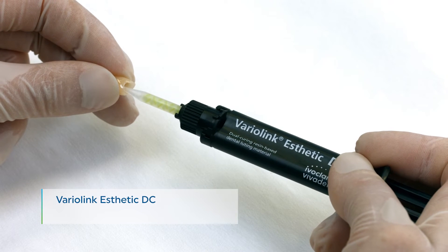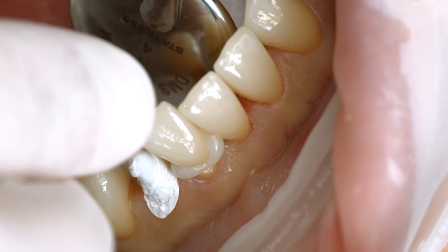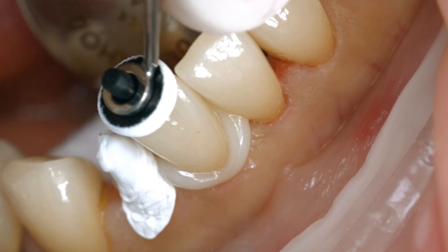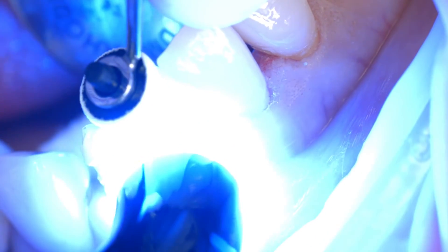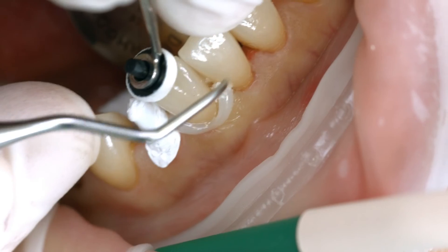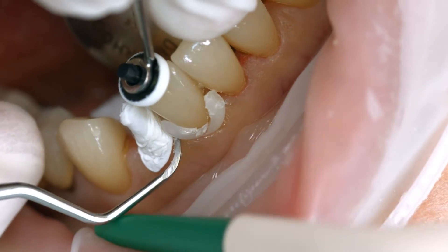Apply the desired amount of Variolink Aesthetic DC directly from the Automix syringe onto the restoration. Seat the restoration and retain it in place exerting uniform pressure. Light cure cement excess for 2 seconds per quarter surface using blue phase style, for example. Make sure the distance between the light probe and the restoration is 10 mm at maximum. The gel-like excess can be easily removed with a scaler; in proximal areas, use dental floss.